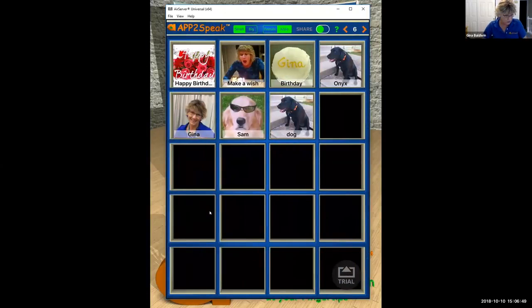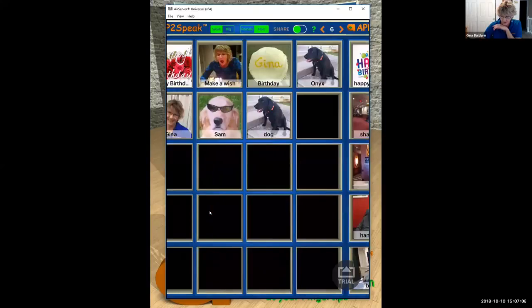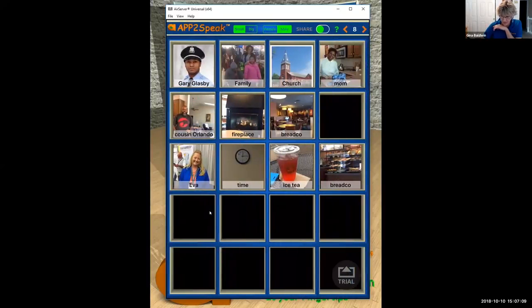You can also share pages if you are working with multiple students, multiple patients, or clients, seeing if they were able to successfully use APP2Speak, and say you created some pages. So for example, I'll slide over and say this page was mastered by my client. And so you'd simply turn on, I'm going to do mirror again and show you the 2 iPads.